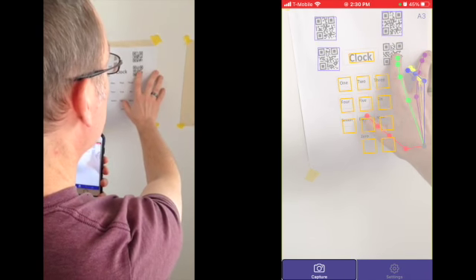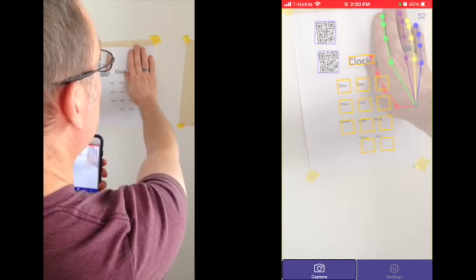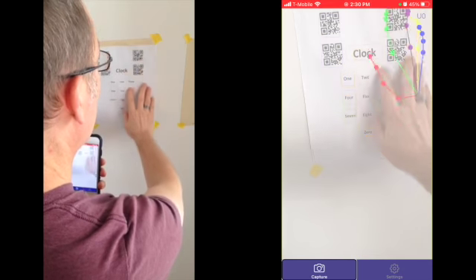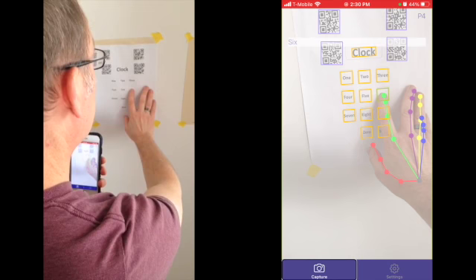Bottom right QR code. Then the QR code will be announced. Bottom right QR code. If my hand blocks 2 or more QR codes, we'll hear the target lost sound. Top right QR code. Then I'll move my right hand down on the target again. 6. And that was the target found sound.